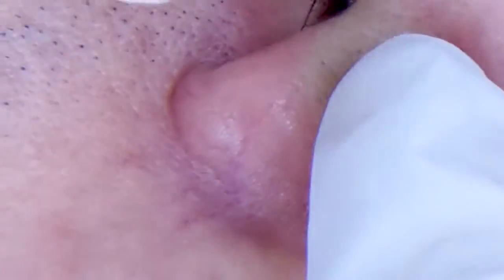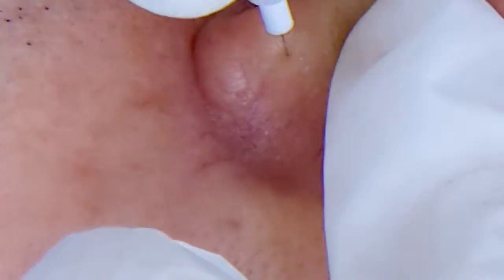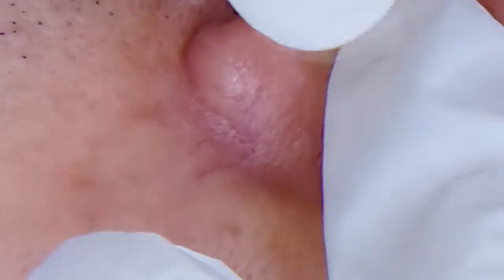Sorry, I'm leaning on you. Okay, 90 degrees like this. Try to use this one as a pivot, so you won't move like this. This is not 90 degrees — this is 90 degrees.